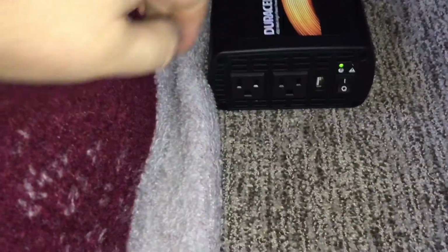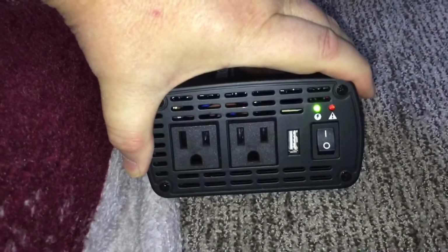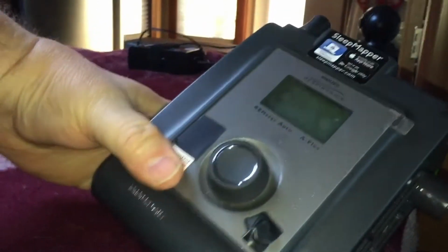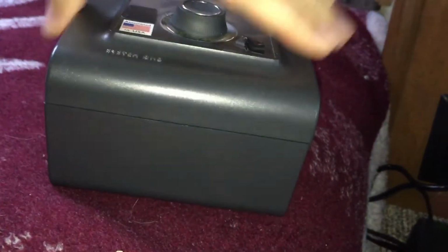Now, that should go green. It's green. When the light is green, the trap is green, as they said in Ghostbusters. Okay, so here's my CPAP. I have a humidifier, but with this demonstration, I'm not using the humidifier. Simply hook it up there. Here's your power.